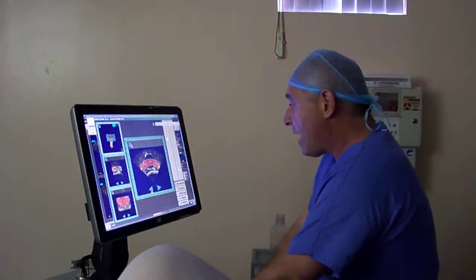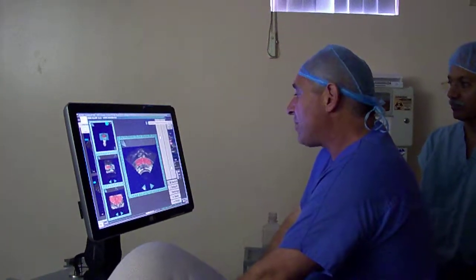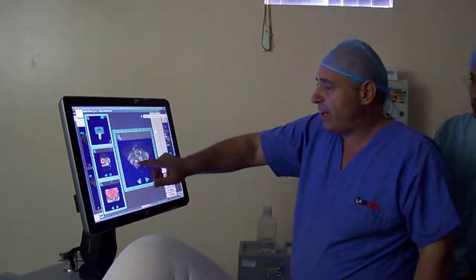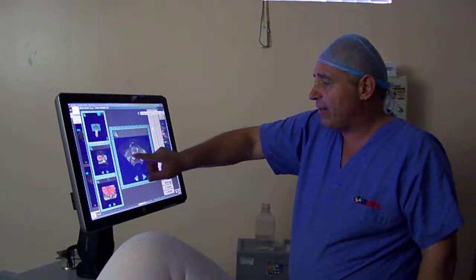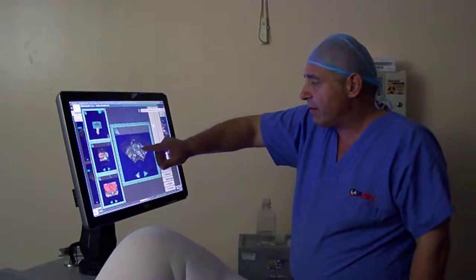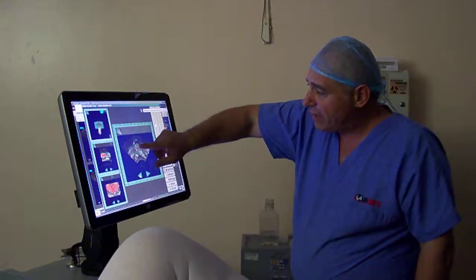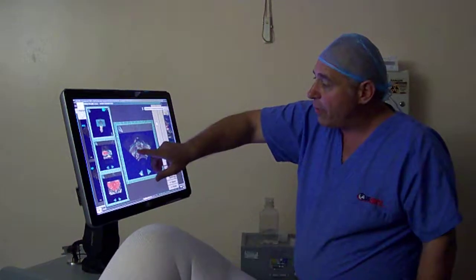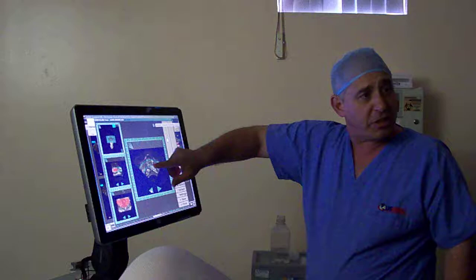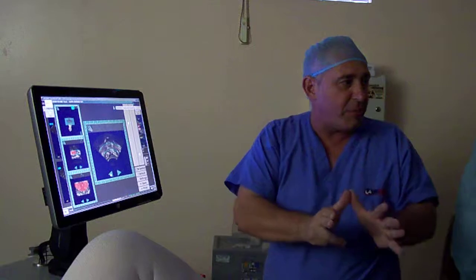Okay? So now I'm going to just sequentially follow this, and I want to ask myself, is the prostate totally covered? Now, this is a transverse plane image. There's the Foley, there's the levator ani. The levator ani are in a plane slightly posterior to the plane of the urethra in terms of their anterior-posterior position. To identify the true apex of the prostate in transverse plane imaging, we want to be absolutely sure that the levators are on the same plane as the urethra. So this image anatomically is a millimeter or two just beyond the apex and into the membranous urethra.